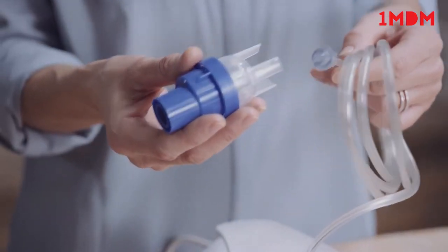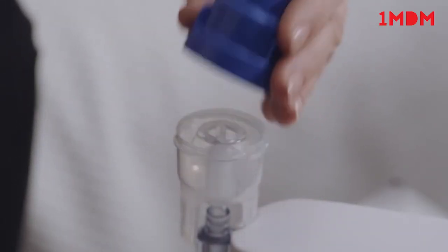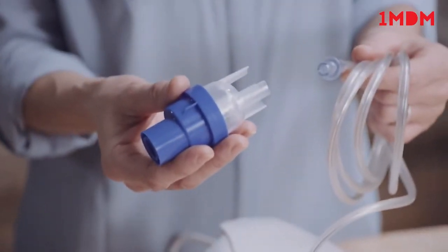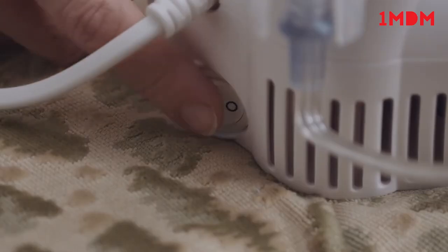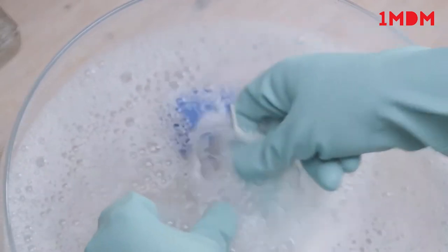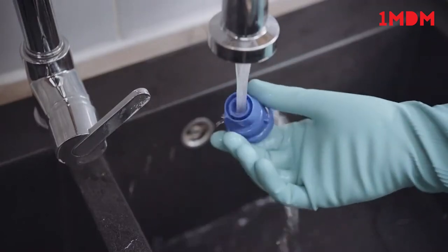Disconnect the Sidestream from the tubing. Unscrew the top from the medicine cup. Rinse out the nebuliser and refill with clean water. Reassemble the top and medicine cup, reconnect the tubing, and run the Sidestream again for a few seconds to flush out any drug trapped in the nebuliser jets. Disconnect tubing from the medicine cup and wash all items, apart from the tubing, in hot soapy water. Rinse all parts in clean water for two minutes.